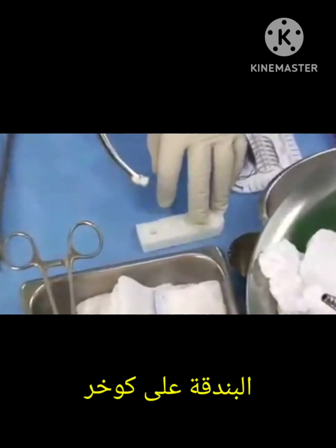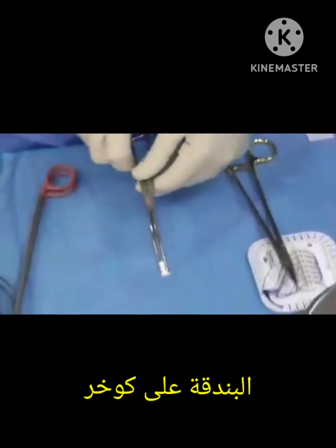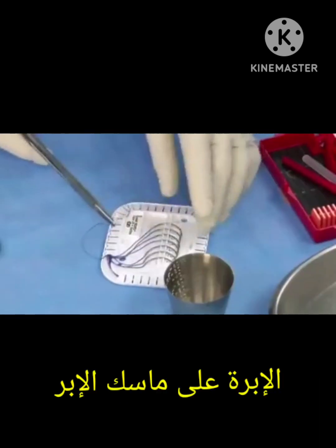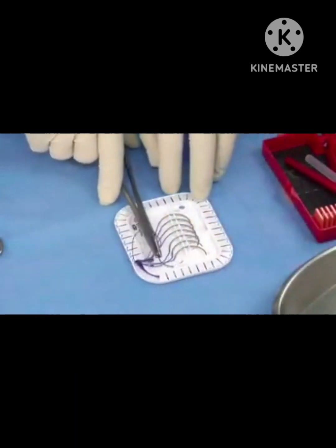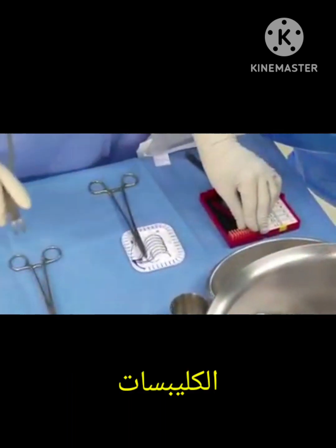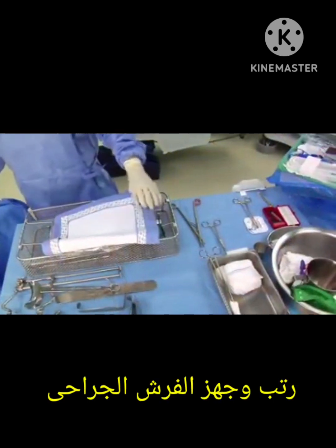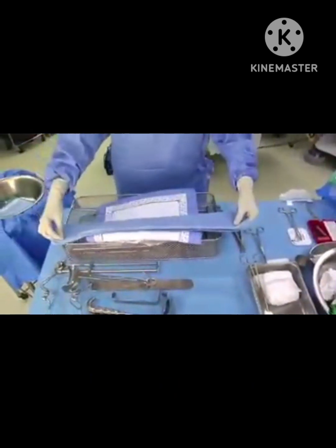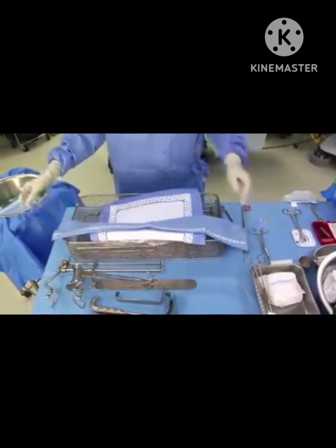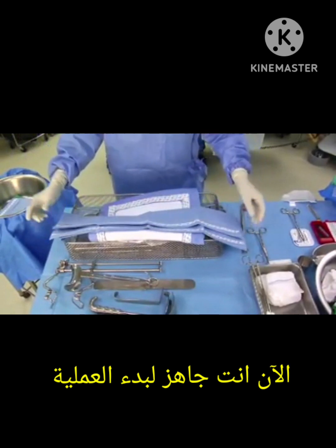When the mayo tray is ready, prepare items on your back table. Fold a gauze sponge into thirds and then in half, load it onto a sponge forcep, and place it in the area of use. Load a peanut sponge onto a mayo or PN forcep, placing it where it will be used. Load the suture that will be used first and rest it in a secure place. Load the staple appliers, organize your drapes in the order they will be used, and prepare to remove the tape strips when required.